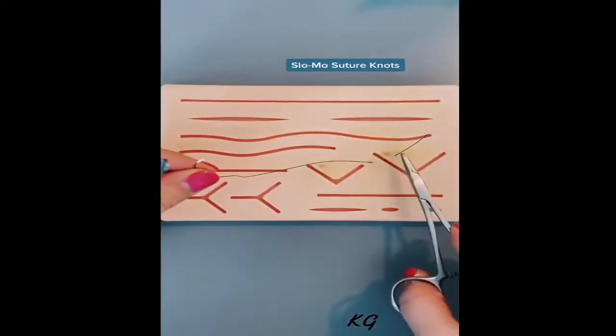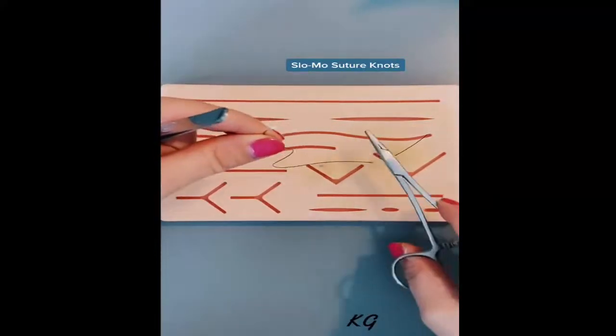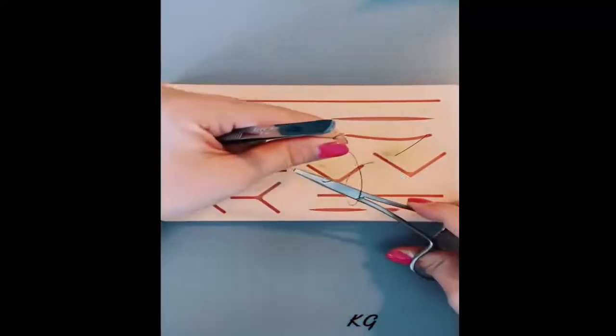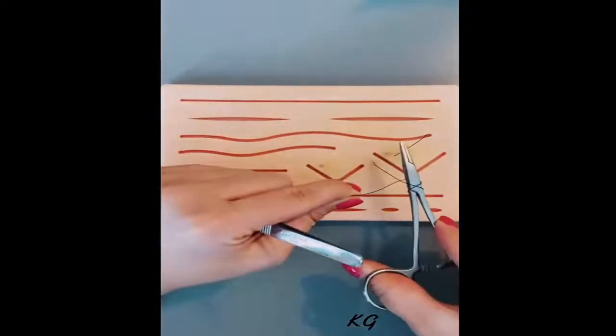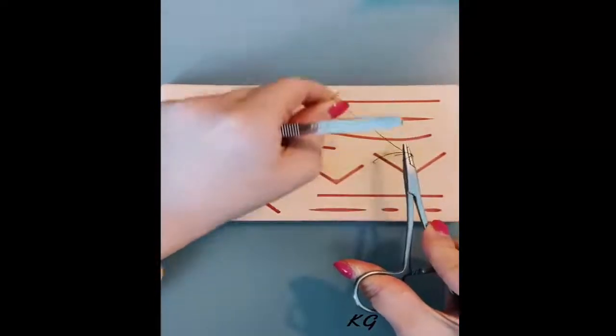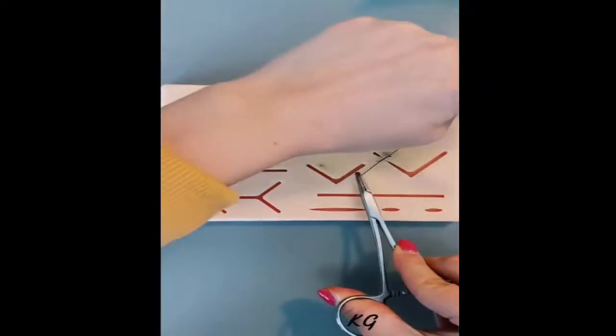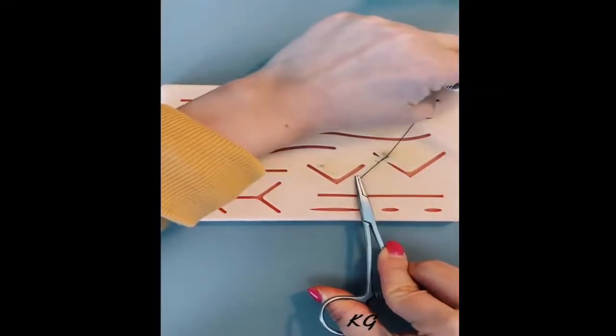How to tie your suture knots, slow-mo edition. You grab your suture, make two loops in the same direction over your needle driver, grab that suture tail, cross your hands, lay it down flat. That's going to bring the skin edges together.